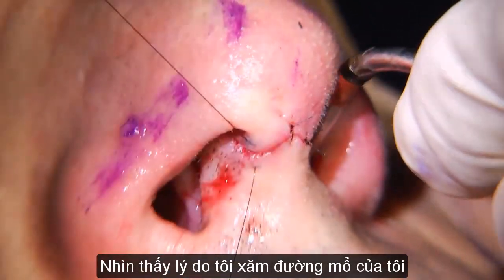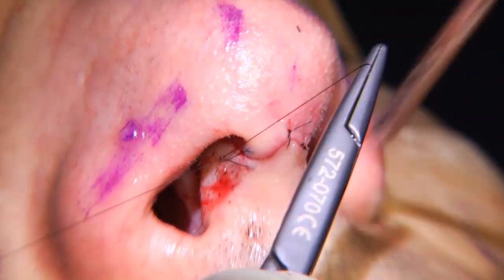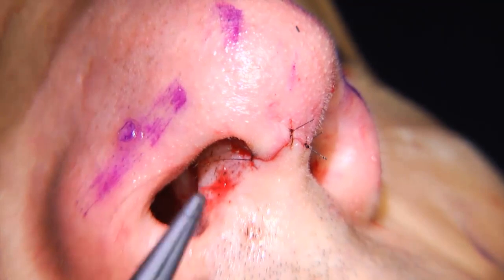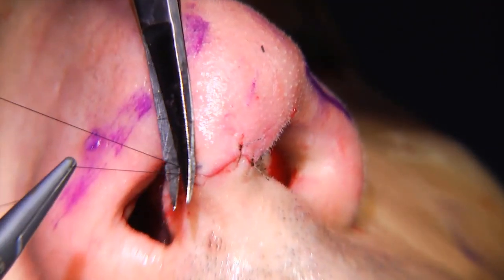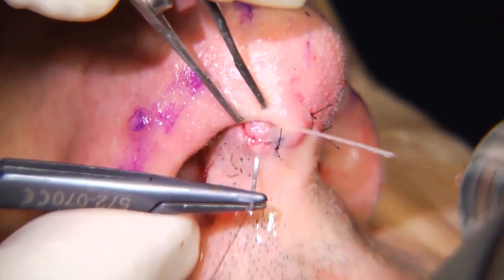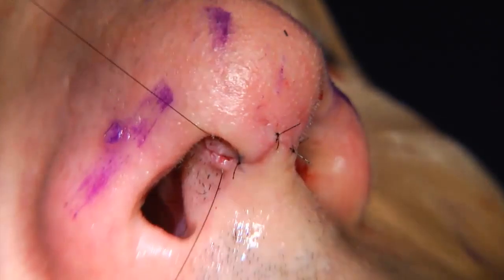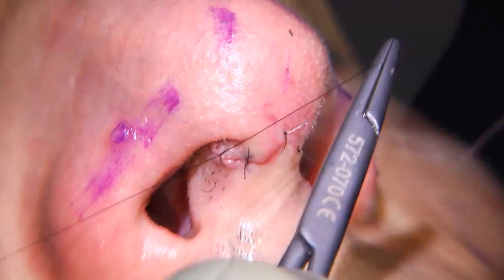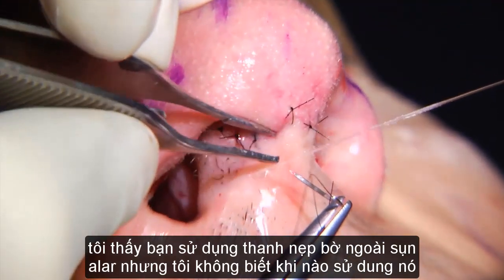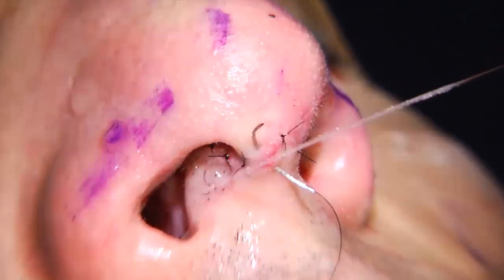See the reason I tattoo my incision? I see you did the lateral crura strut, but I don't know when to do it.